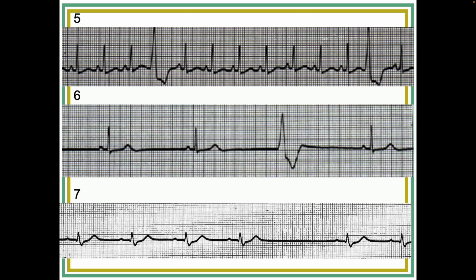Yes. Because this brady is so slow that it's right around what the intrinsic rate of ventricles would be. I feel like this is really treading between escape and premature, because it could be coming in a little bit early of what that sinus rhythm is. Yeah, but it's also that the brady is so slow that it could just be wanting to take over because it's going so slow.